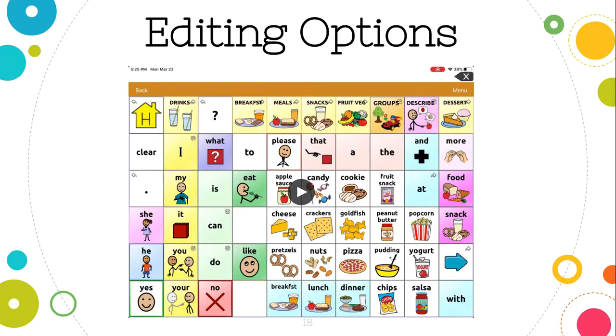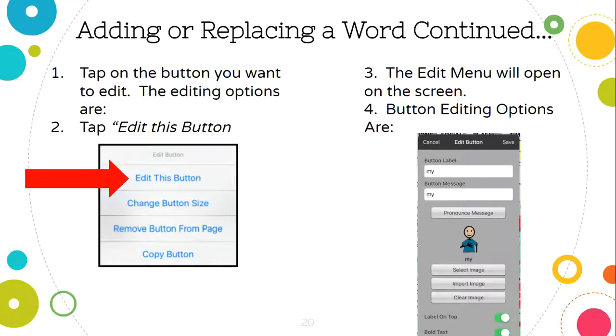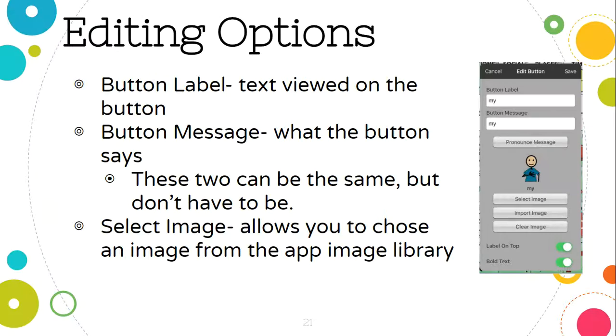And just like I said before, I will upload these individual videos to my YouTube channel so that you're able to come back and just watch that if you want. And so then again, here we have the written directions with some arrows to show you, if you like to learn with reading, a way to do it. So that's there. So again, this goes through how to add a photo.